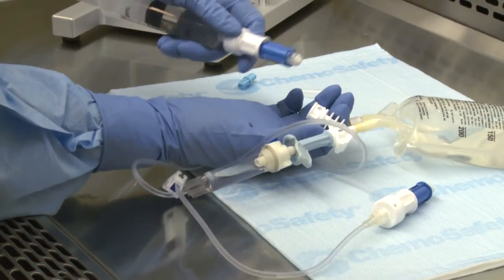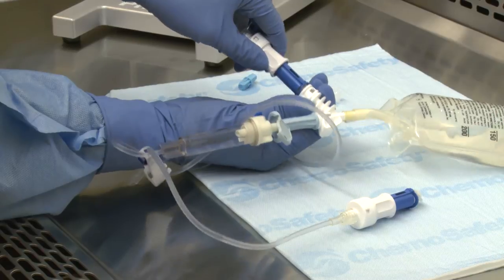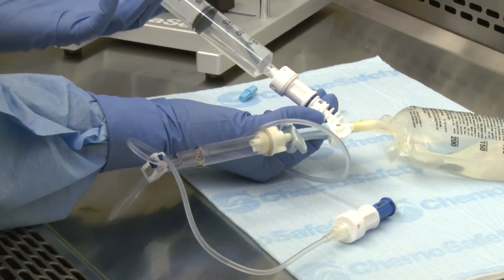Next, engage the prepared BD-facil syringe unit to the connection interface on the infusion adapter. Engage the syringe unit using the push-turn-push technique and push the drug into the IV bag.